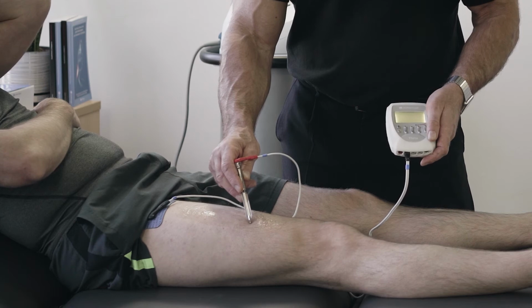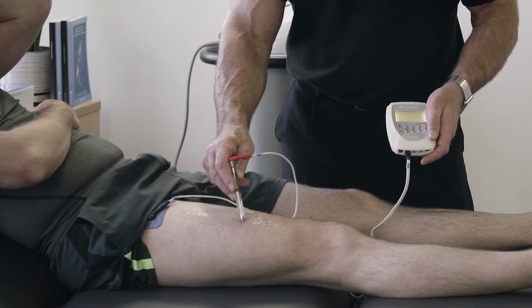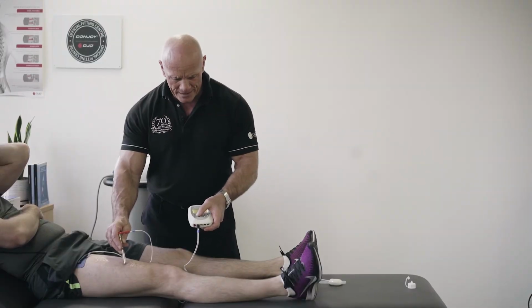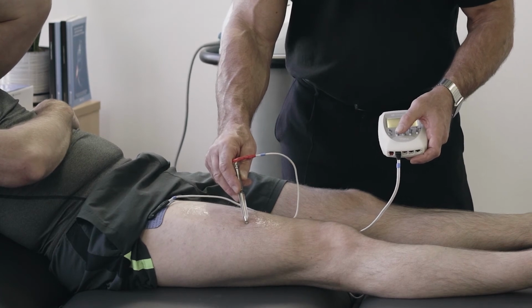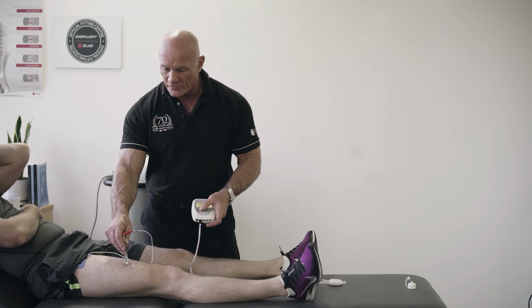But as I move the pen around, I can find the motor point. And the lower number that I have in here, the more specific I can be. So I just reduce this to 3. As I move it away, it stops. As I move it back over, it comes on. So you'll see with this patient, we're in the distal third of the muscle, the vastus medialis.